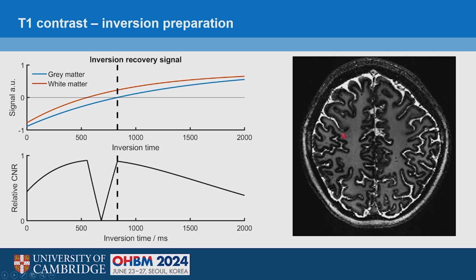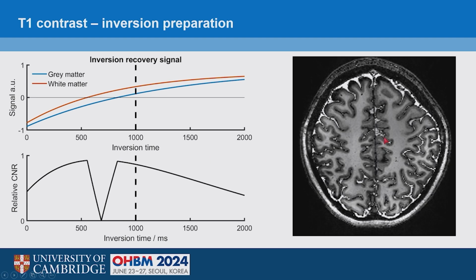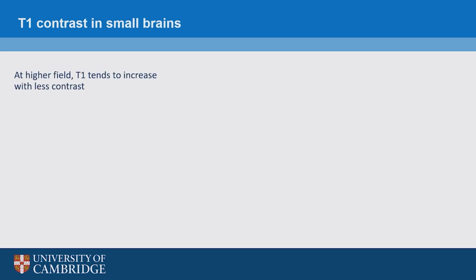So the image I'm showing you here would be the inversion recovery signal. That's like the MP-RAGE with just the MP part. There's no RAGE, and this is with a long TR, so the CSF is still bright in this picture. In practice, we would actually go a bit longer so that the signal's recovered a bit, so the signal to noise is higher. And this gives us good images for the human brain because of the difference in T1 and T2. T1 and proton density, sorry.